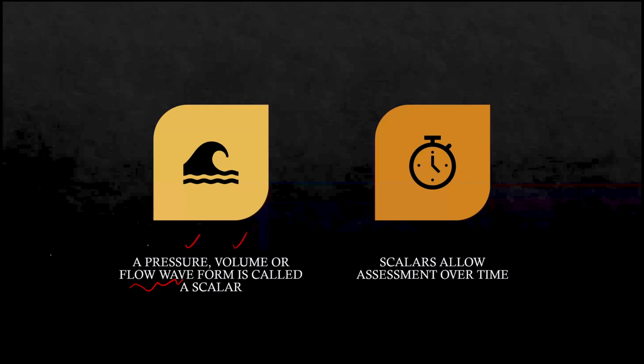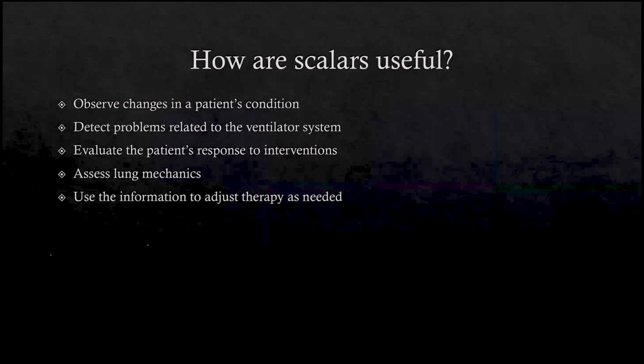And if you bring time as a constant into that, you're actually bringing in the whole concept of ventilation into it. And of course, based on that, as I said, there are different modes which we know about, and essentially it is playing with these three aspects of gas flow, which is pressure, volume, and flow.